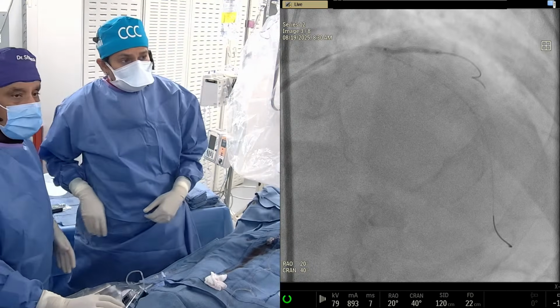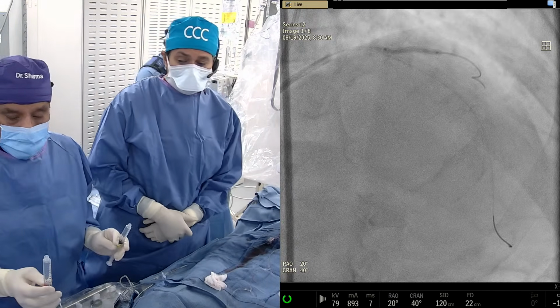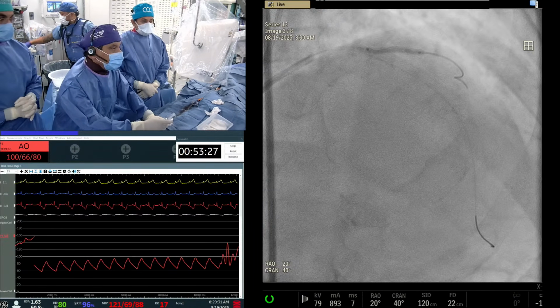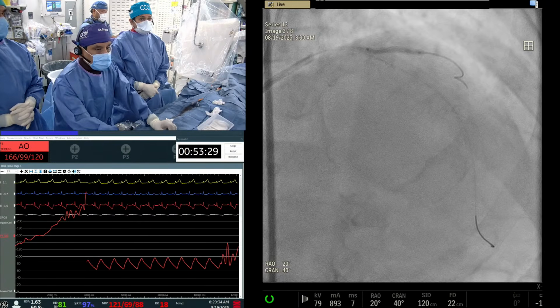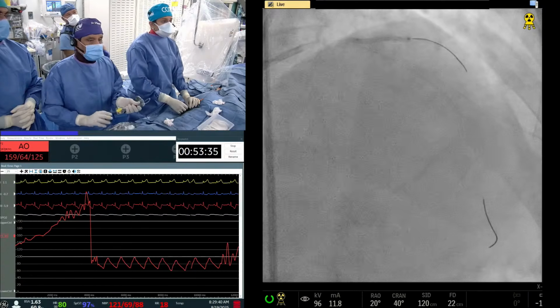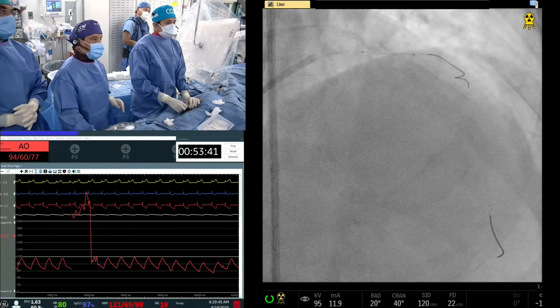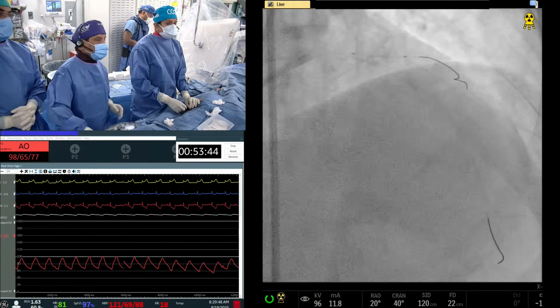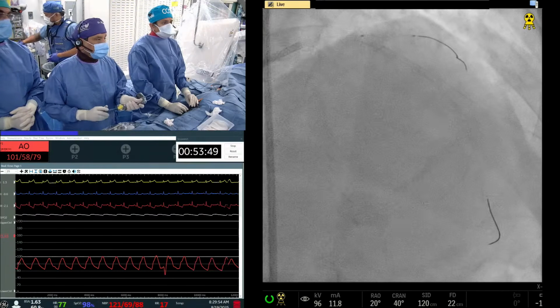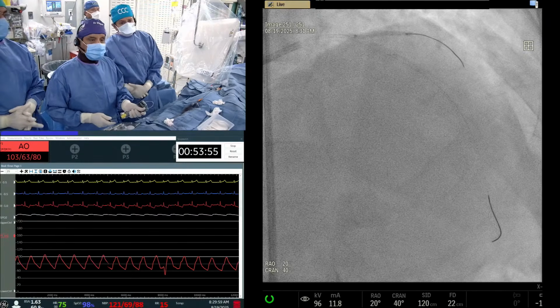Okay, look at the EKG changes, the ST elevations. Can we show the ECG and hemodynamics? Very significant. So, a big diagonal. Is it occluding the LAD? Maybe part of that could be occluding the LAD. Come down. There was also a little plaquing in the left main. Maybe the guide catheter is outside, I don't have it engaged at all. Okay, we went inside and let us see now. Significant disease.